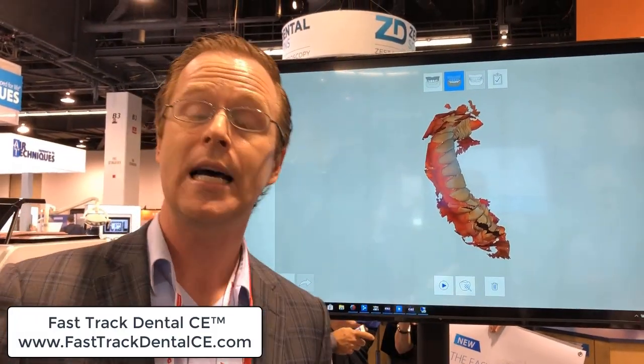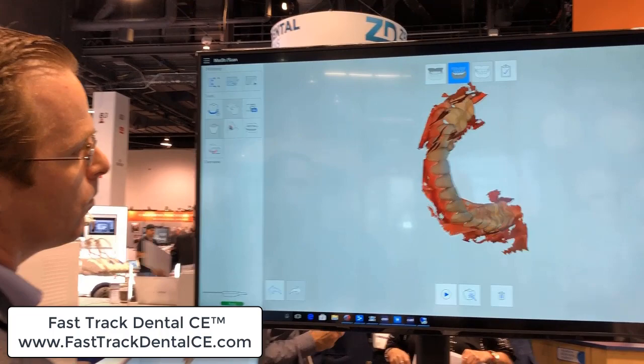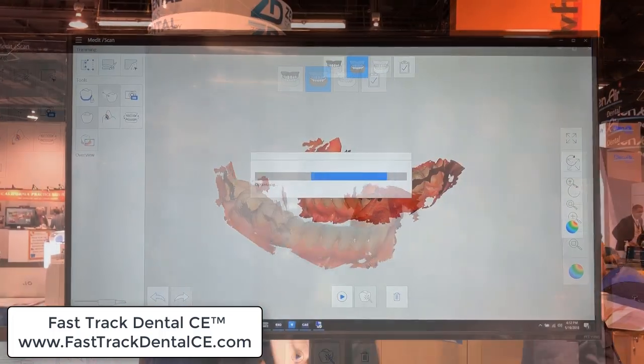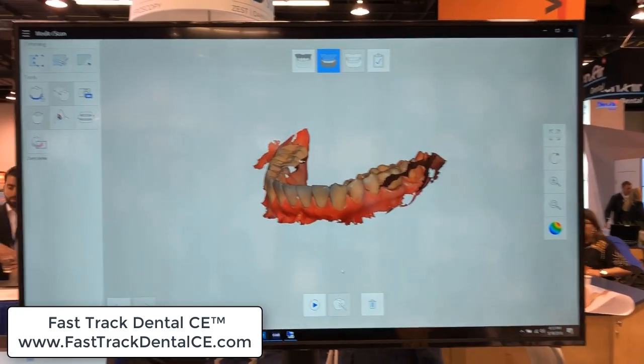That's been roughly about a minute. Let's take a look at how close I got with this scan. You saw how fast it went — let's come in and take a look. Sliding here on the screen — really not bad at all. Now I can do a cleanup image with this button right here. The computer automatically goes through the algorithm. Is Trios a little bit faster? Yes. A little bit sexier? Yes. Last time I saw this scanner on a model, I said it still had a little ways to go. But after scanning it here today at CDA, the scanner is ready — full speed — blowing my mind at how fast this thing works. Coming right back to here, focused right there.